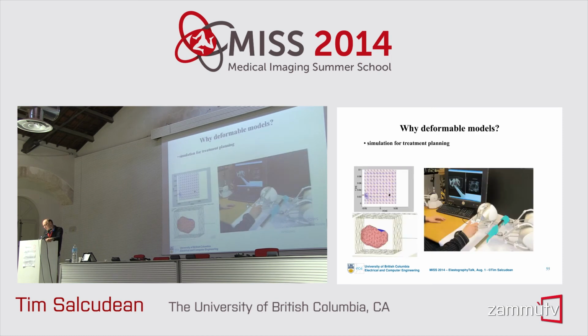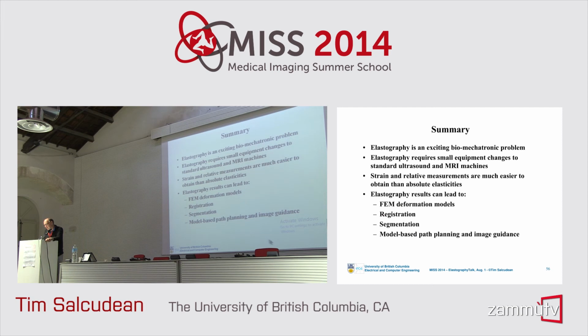So there's a lot of potential for image guidance, and we can use this also for simulation and treatment planning.